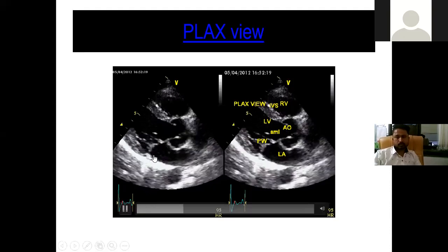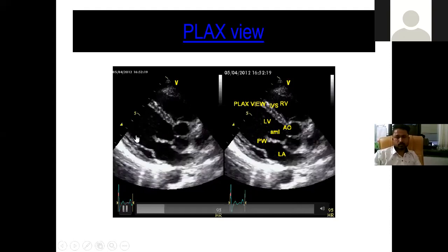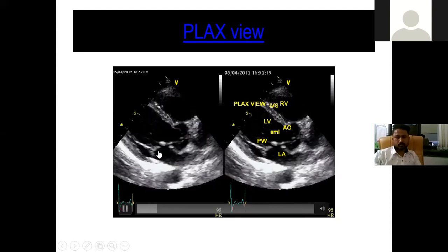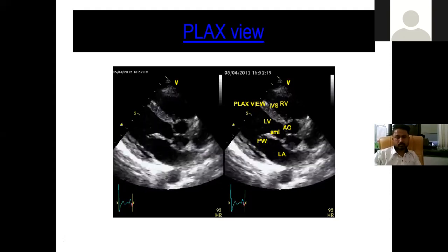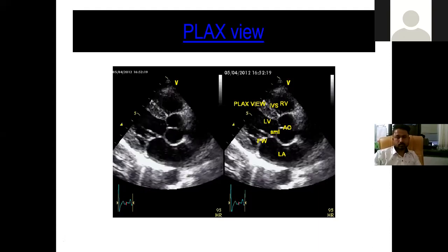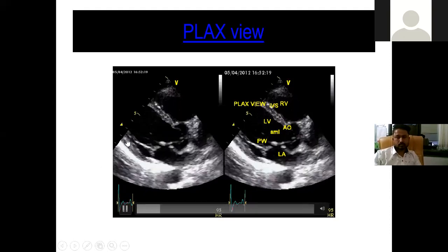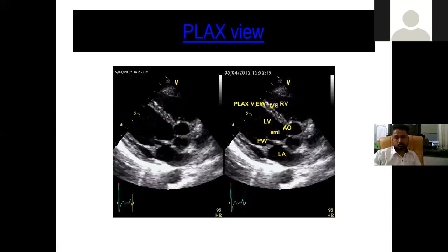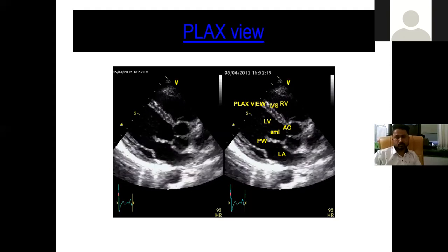Now look at these mitral leaflets. This posterior wall does not have a papillary muscle. Suppose you happen to see a patient with significant mitral regurgitation. The patient comes with dyspnea on exertion. He talks of a mild chest pain. And with mild exercise, if this MR increases, it means we are dealing with ischemic papillary muscles. Who else can give you this information? Echocardiography, none other than that.